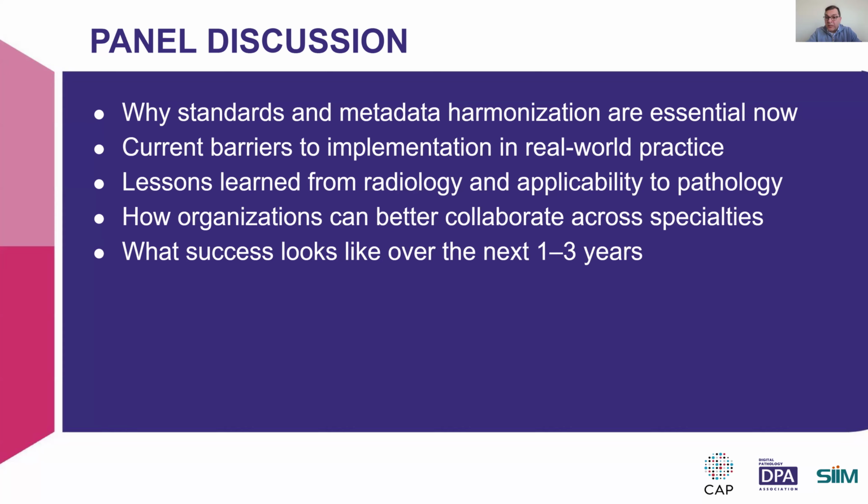So there is a possibility of having a different tier of storage system, maybe a cold tier and hot tier, making sure that we need it for the first 3 to 6 months. As you know, in pathology, we just need it for making diagnosis and maybe tumor boards.